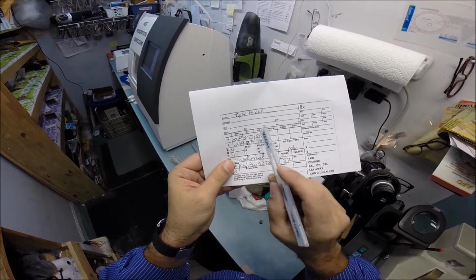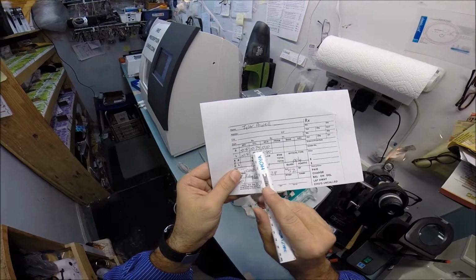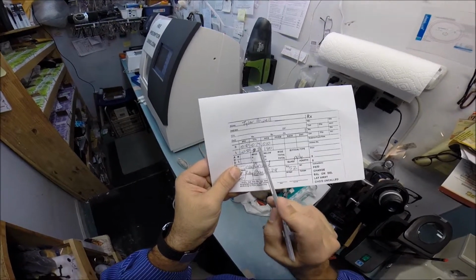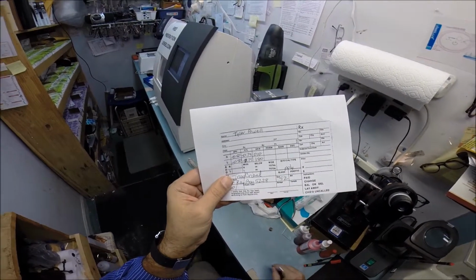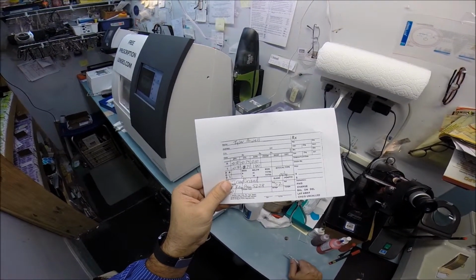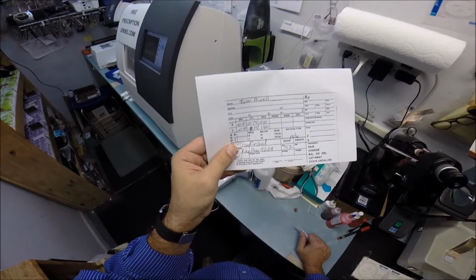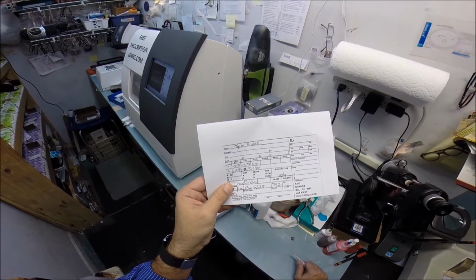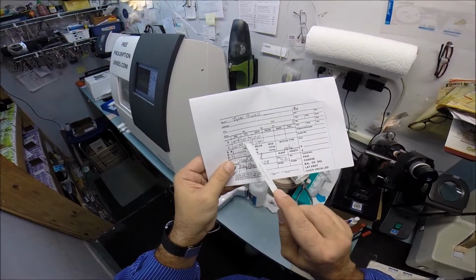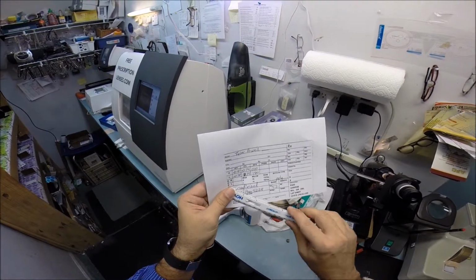These first 2 numbers are real values; the axes are not. You need 2 steps of correction to minify. You need 3 steps of correction to take away fuzzy edges. That's what astigmatism is. It makes letters, the P and F look alike, the numbers 6 and 8 look alike. Think of it as the fine-tune knob. First number gets everything the correct size, second number takes away fuzzy edges.